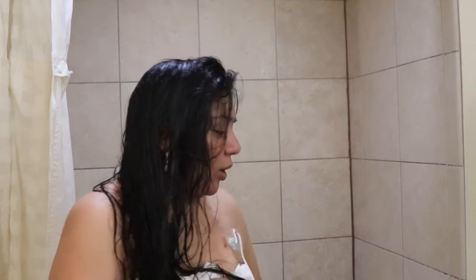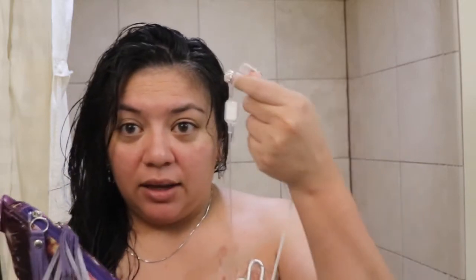So that's not something you want to do. You want to put it on the toilet, or somewhere else lower, where you can feel safer. But if you're fine and normal and you can stand and bathe yourself, doing that is okay. I like to keep it up because if water runs down the tubing, it can go into the machine, and that's something I try to avoid. If I put the machine on the ground and I'm taking a bath and water's running down the tubing, where is it going to go? You know what I mean? Into the machine, and that's not something you want. So you have to keep it elevated off the ground, above where the lowest part of the tubing lands. So just be mindful of that.